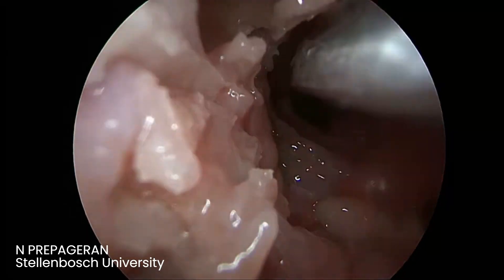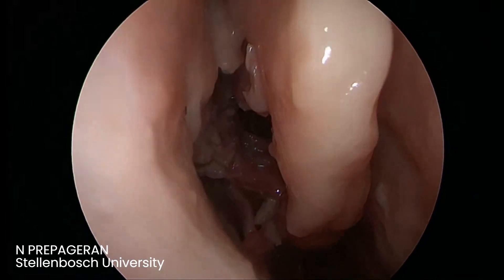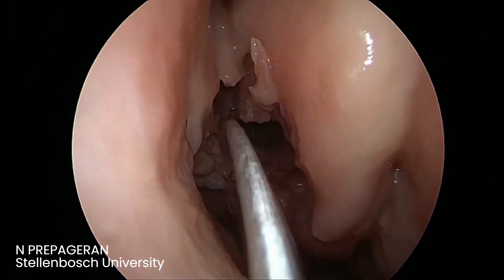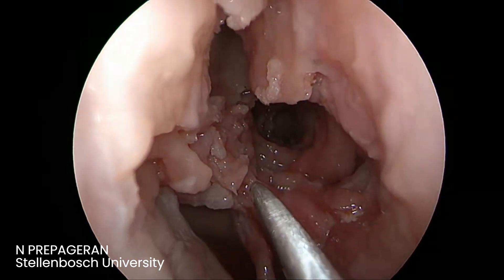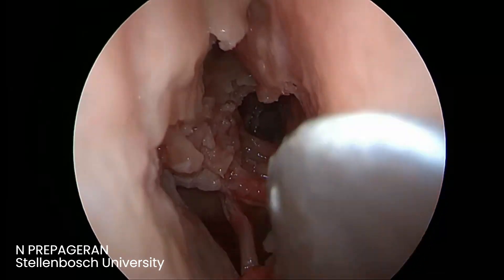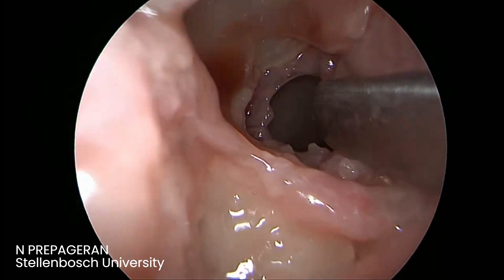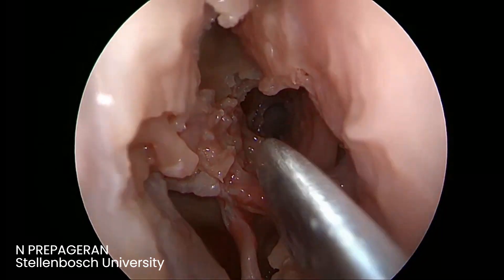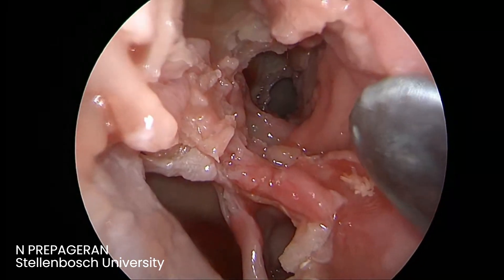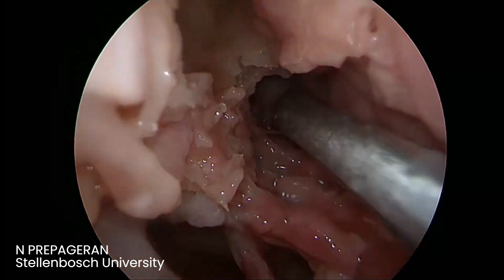We've removed the uncinate — that is gate number one. We've removed the bulla — gate number two. The ground lamella — gate number three. And also the anterior wall of the sphenoid — gate number four. But if you look at it, we have preserved the mucosa all over. Can you see? The mucosa is preserved everywhere. The healing process will be very nice. This is how you want to do a simple, basic functional endoscopic sinus surgery. Any questions about this?